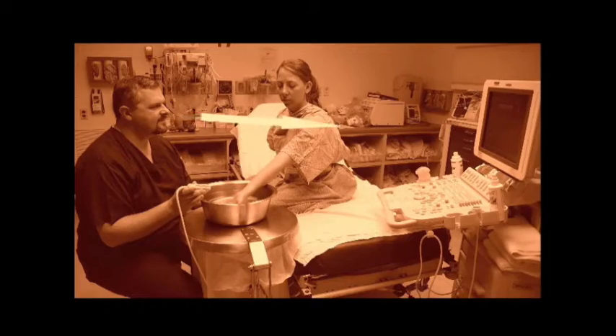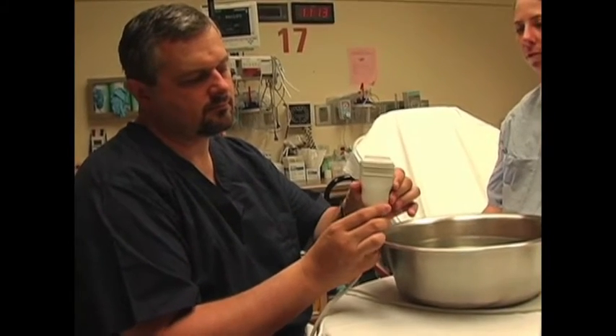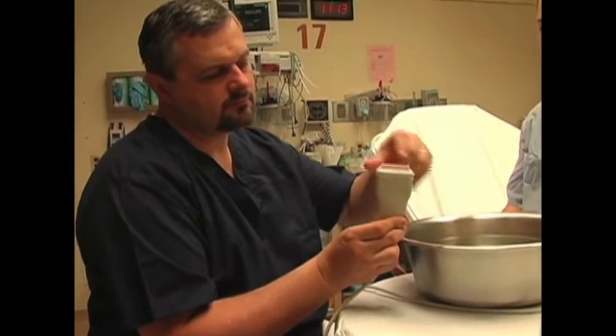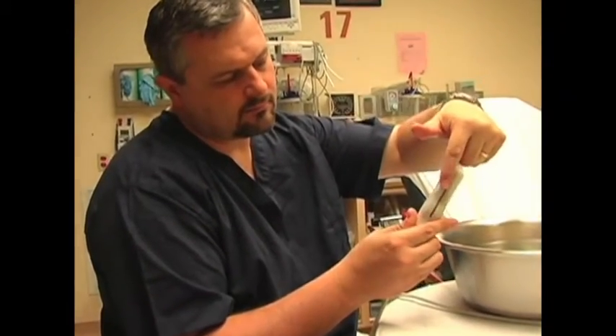Dan is having the machine positioned in his direct line of sight so he does not have to turn his head while he's performing the procedure. A linear, high-frequency transducer is optimal for scanning the finger. Inspect the transducer to make sure the casing is not cracked before you put it into the water bath.